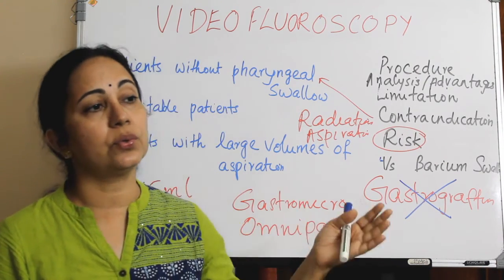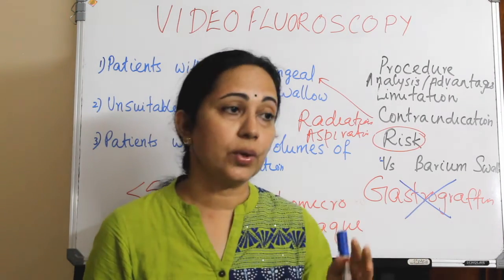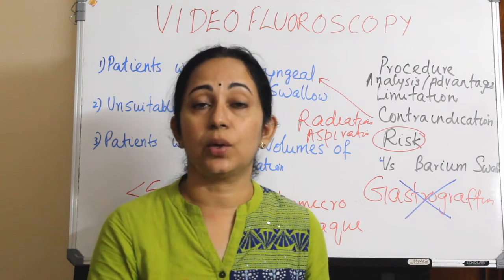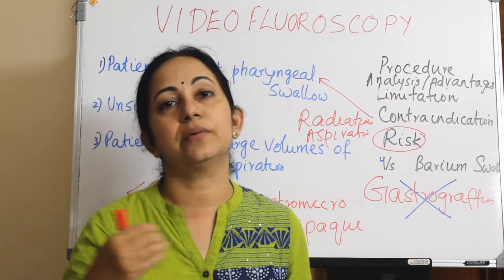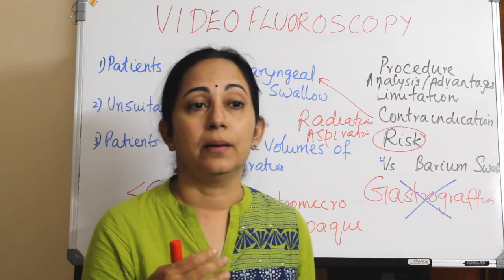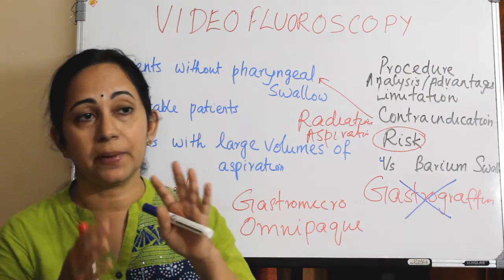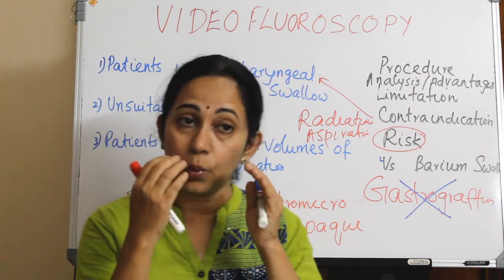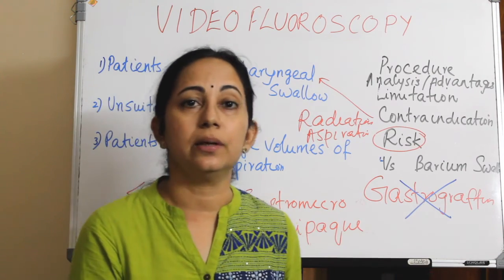And if you want to get detailed swallowing phases of the oral as well as the pharyngeal, and also the penetration and the aspiration details, we have to go with the videofluoroscopy. And this videofluoroscopy is mainly done by the speech pathologist. So this is the basic difference between these two. So more dynamic, more advantage is with the videofluoroscopy than doing a barium swallow.